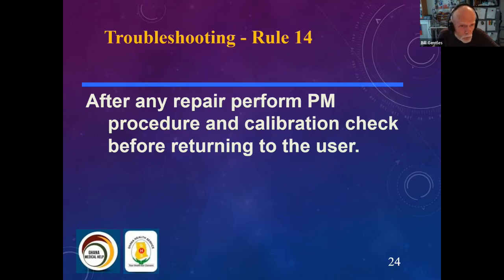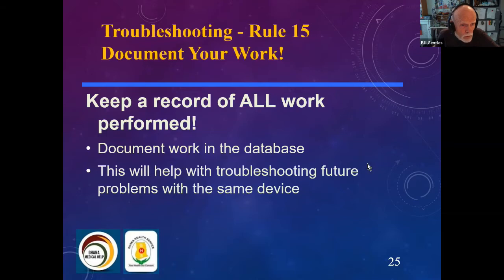And rule 15, please keep a record of all work done. Document your work in the database if you have one. We're hoping soon to be able to provide everyone across Canada with a functioning maintenance management database, but even keep a paper record of the work you've done or put it on a spreadsheet. This helps in troubleshooting future problems with the same device.